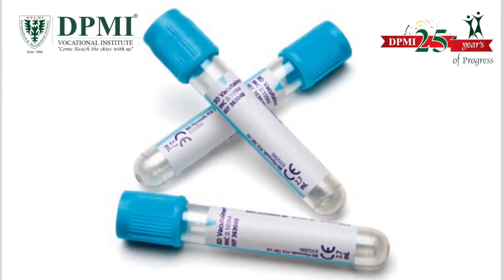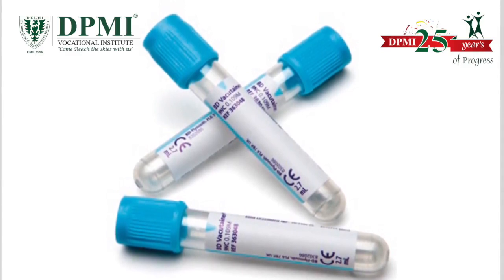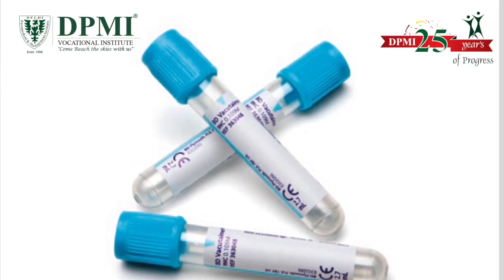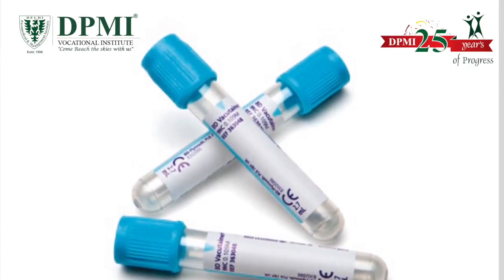Light blue top. The light blue tubes contain an anticoagulant, sodium citrate, and are useful in blood coagulation assays like prothrombin time and partial thromboplastin time.